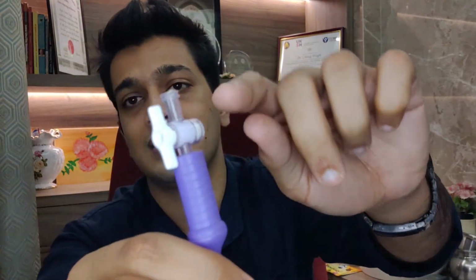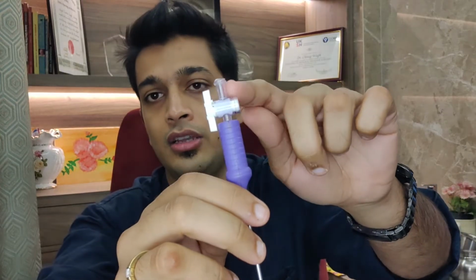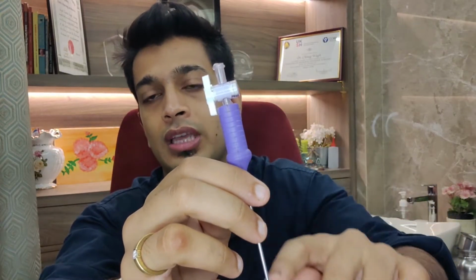So when you push the saline through the syringe at this level, you can actually see that it is a transparent reading here. When you push the saline, it should drop in level and go into the cavity, because the peritoneal cavity has a negative pressure. So it pulls the saline into it, and that is your hanging drop test. If these 2 tests are good, you connect your gas tubing to the Veress needle and you start your gas.